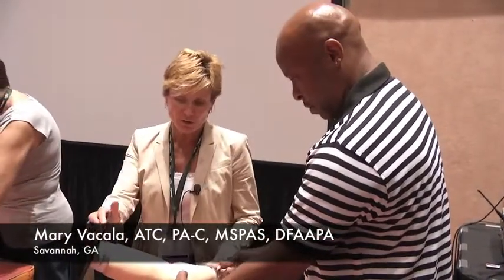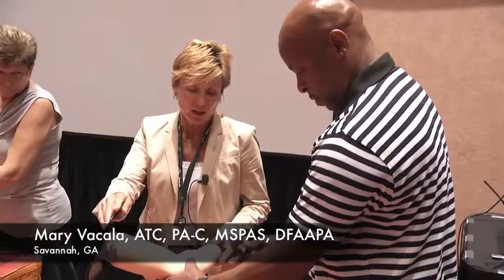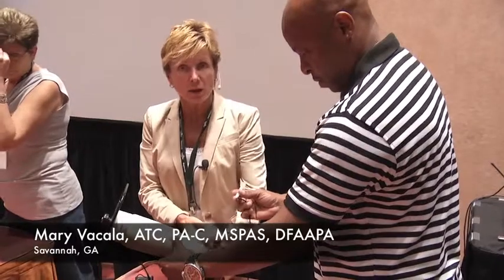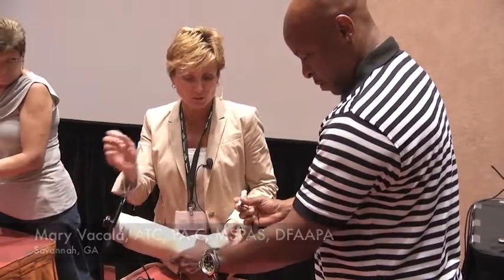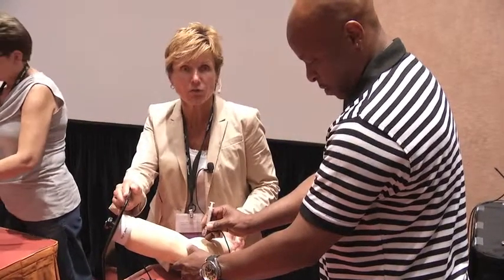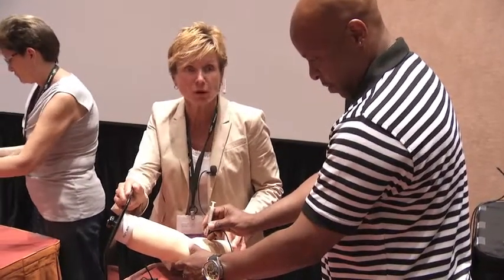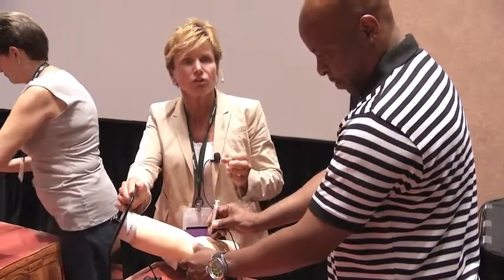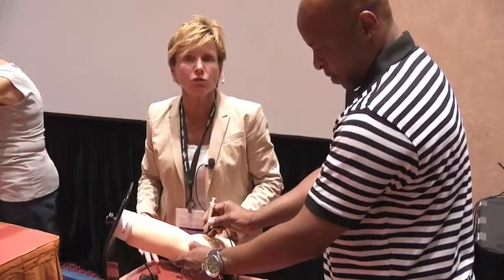We're practicing joint injections, soft tissue aspirations and injections. James is practicing lateral epicondylitis, so we've got the elbow here. These models enable you to actually palpate, make sure you find them in the correct place, then practice injections to see if you have correct needle placement. It'll tell you if you do or you don't — it'll light up either way, same as a patient will. It's not giving you the correct feel of a real injection, but it's giving them good anatomical placement.